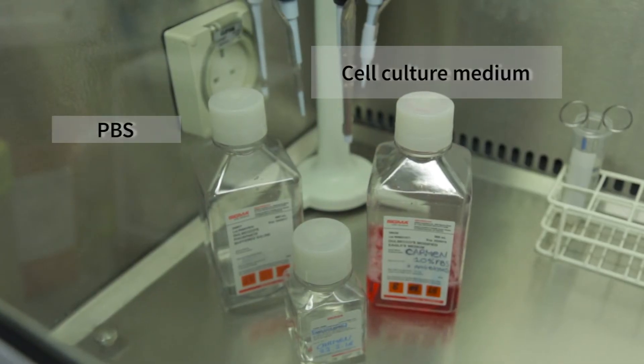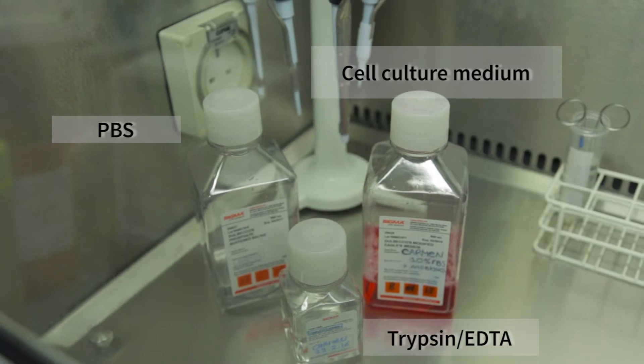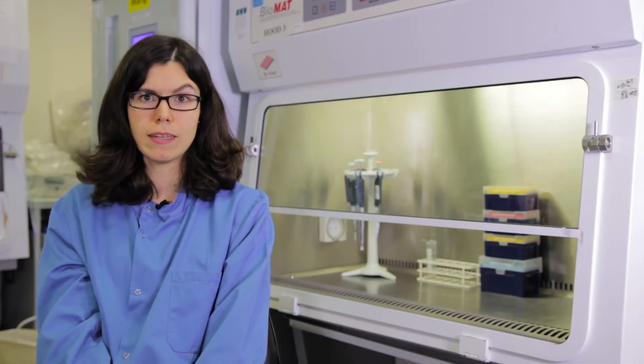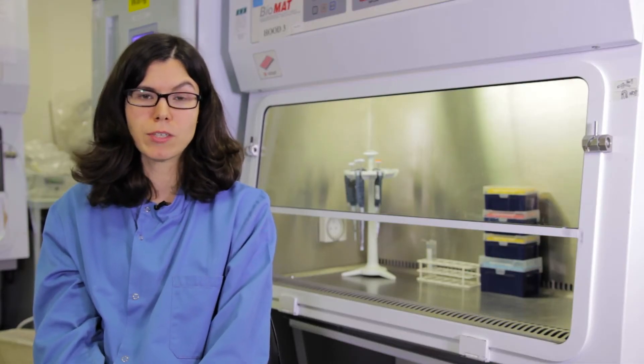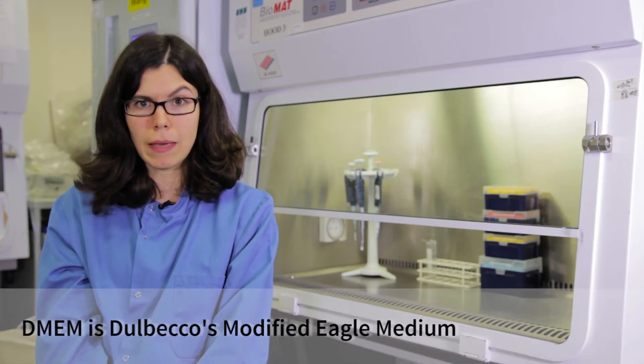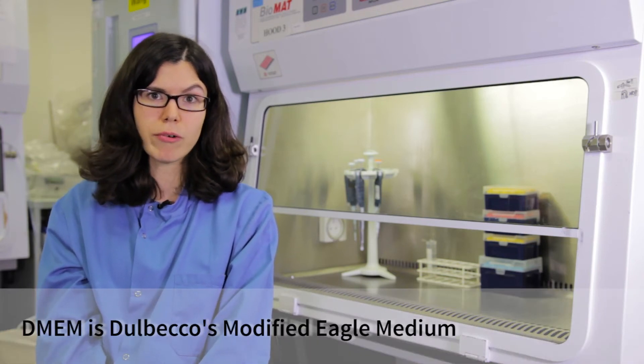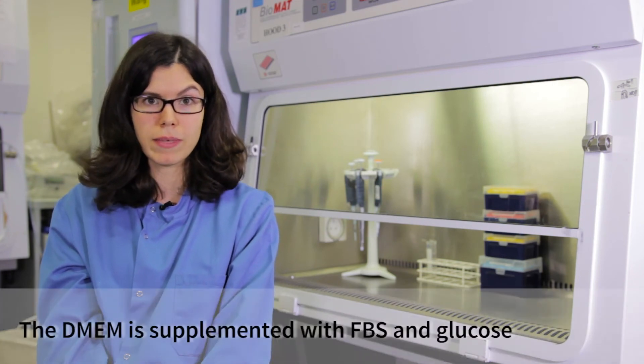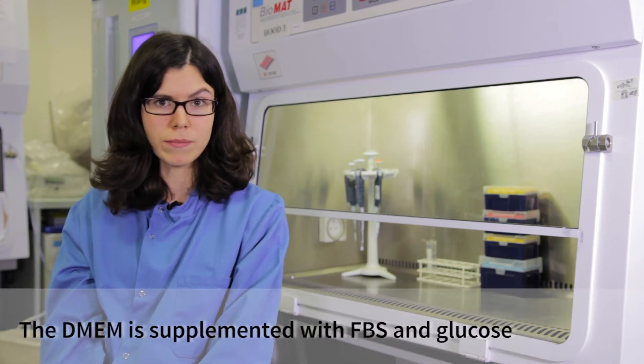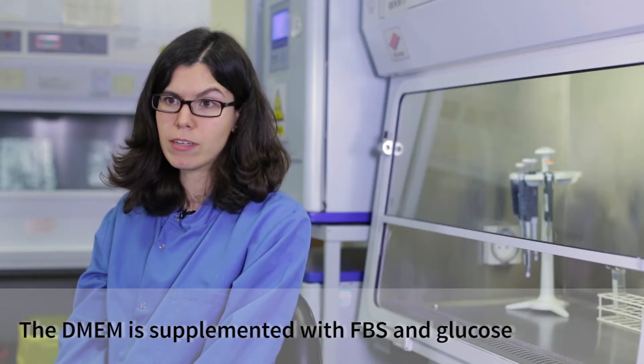Today, I will use medium, PBS and trypsin EDTA solution to subculture one cell line. There are different types of medium. I will use DMEM medium due to the special requirements of my cell line. It has been supplemented with FBS, fetal bovine serum, and it contains high levels of glucose.